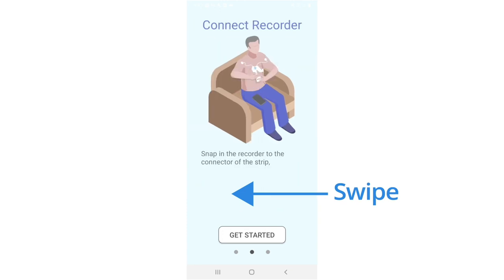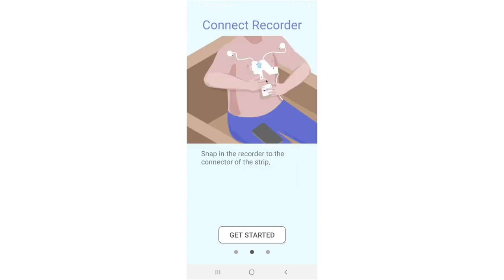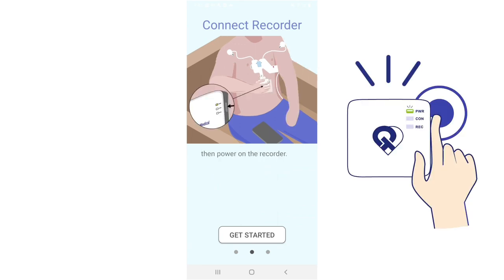Swipe to the left for the next tutorial. Connect the recorder. Snap in the recorder to the connector of the strip, then power on the recorder by pressing the power button until you see the lights flashing.